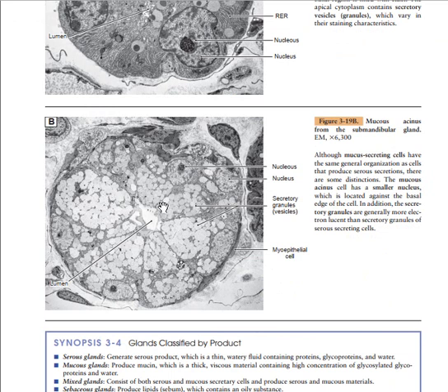That is why, in the image we saw earlier, you can pause and go back, you see a whitish apical appearance at the level of the mucous gland. You see many whitish areas inside the mucous gland, and inside is the lumen of the particular mucous acinus.